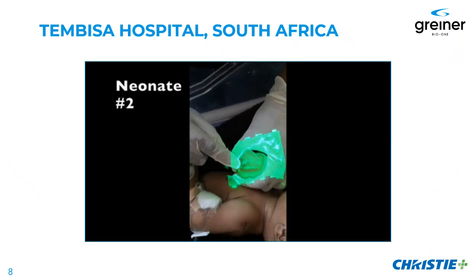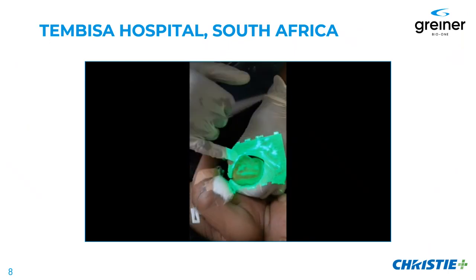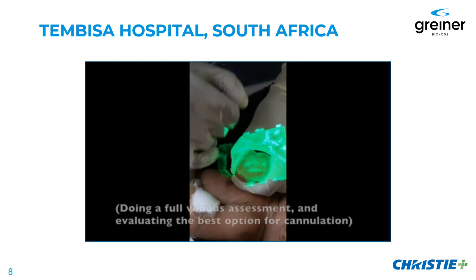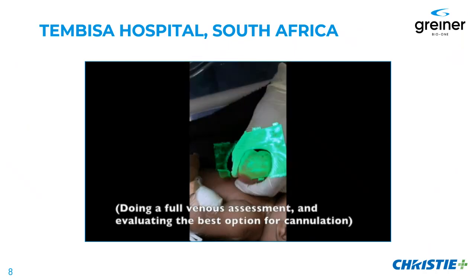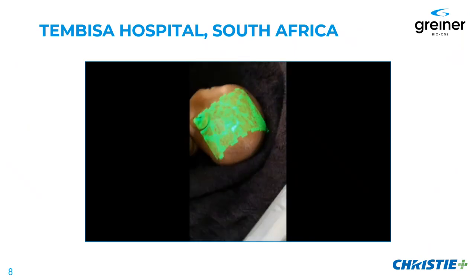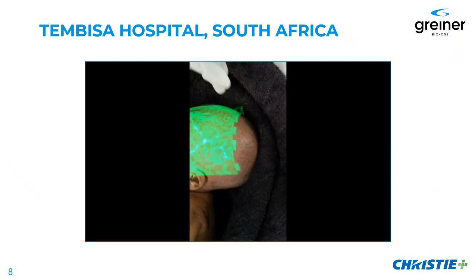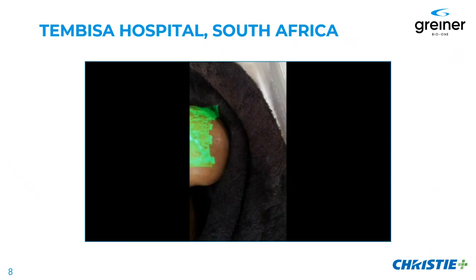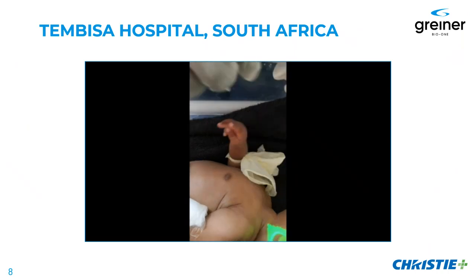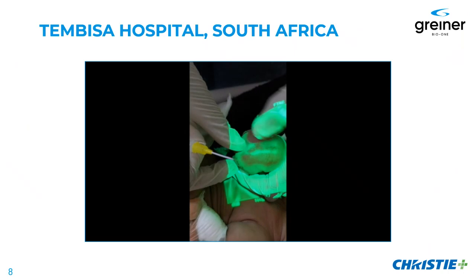Okay. So here we can see there's this one here that we can see, and then there's this one here as well that we can use. We decide to use this one. This one looks like it might have been punctured, yes, but I think we can still use it as well. And would you look anywhere else? Yeah, on the head we can see that there's this one, and then there's this one. So what sort of things are you looking for? You're looking for things like valves? Yeah. So you can see with the VeinViewer if it's been damaged and where there are valves.